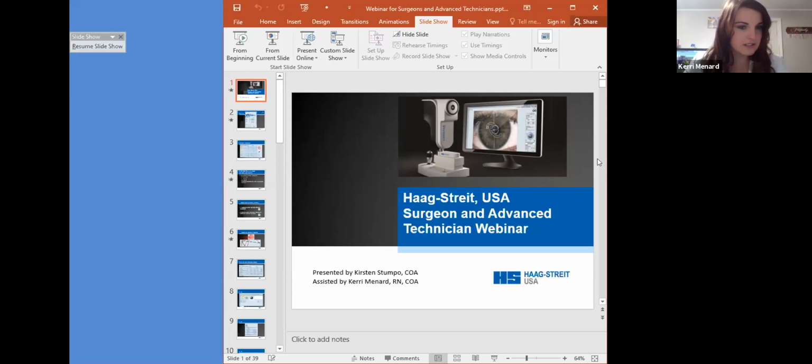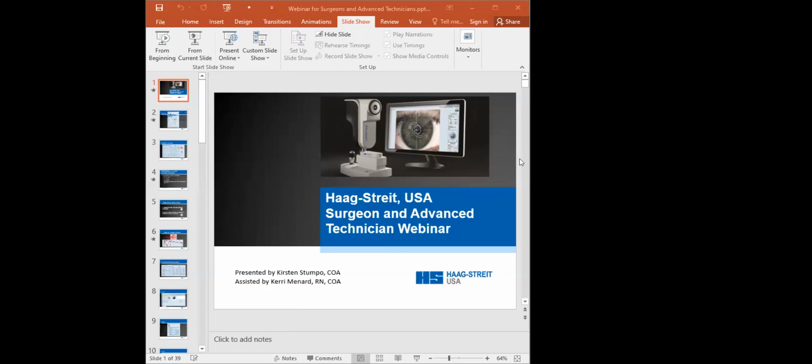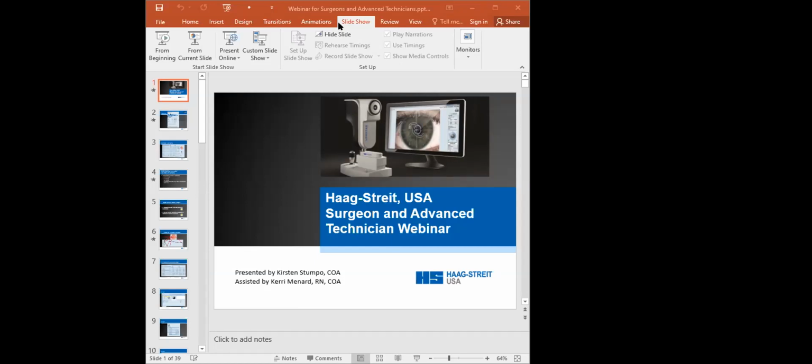Okay, are there any tools to help with my toric lens alignment intraoperatively? So as far as microscopes, I'm assuming that question is kind of along the lines of using a microscope. I would think more just maybe repoint out the surgical planner with the overlays and the angles. Oh, okay, yes. The surgical planner, let me just go back to that and show you some more features there.